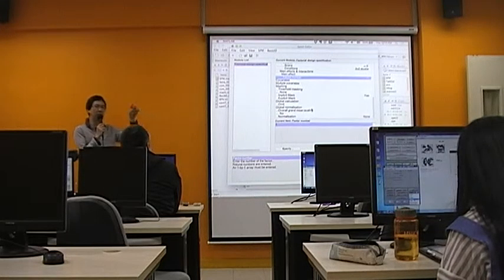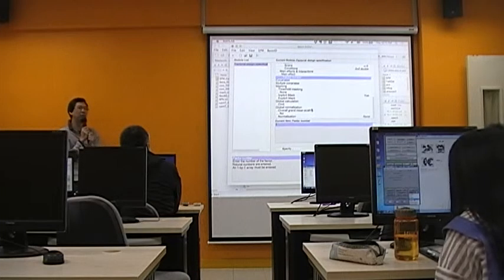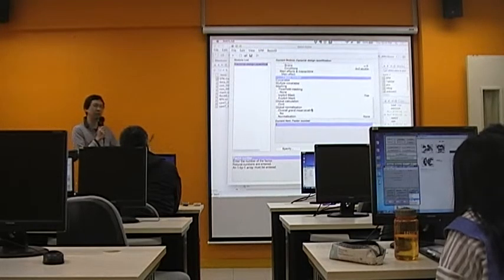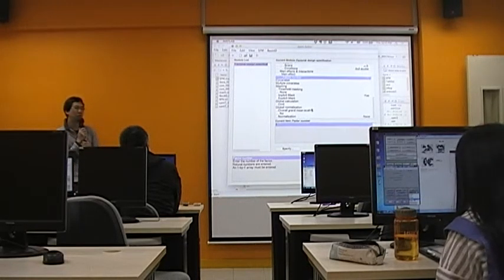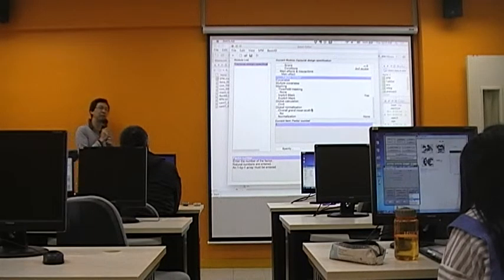For example, 1 minus 1 or minus 1, 1 to compare 2 back versus 1 back. So you are saving the contrast equation for the second level instead of setting it up in the first level and bringing the contrast value to the second level. It's a matter of sequence of doing things, whether you do it at the first level or at the second level.